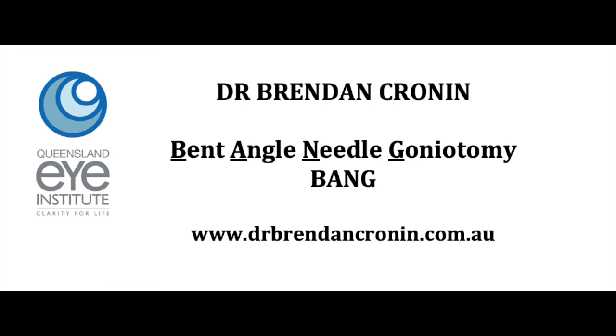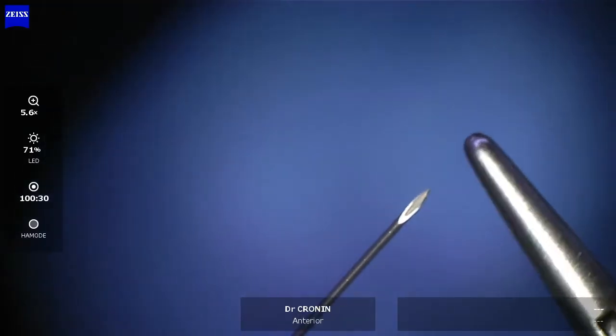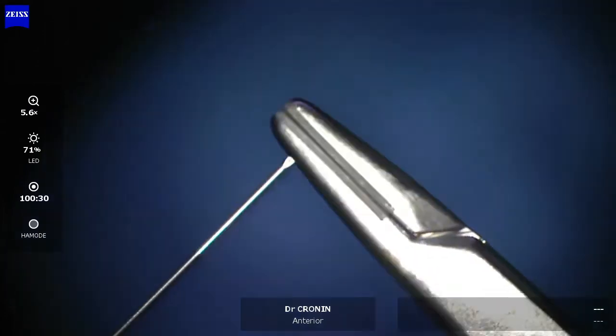Hi, this is Brendan Cronin from the Queensland Eye Institute, demonstrating the technique of bang or bent angle needle goniotomy used in patients with primary open angle glaucoma at the time of cataract surgery to try and reduce their reliance on drops, typically done in patients who don't have insurance where the cost of a stent is excessive.